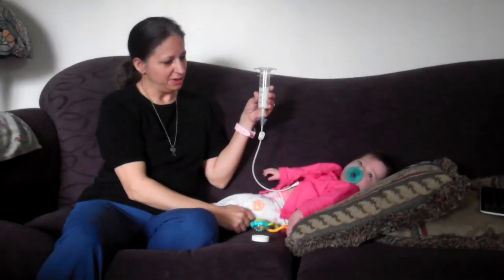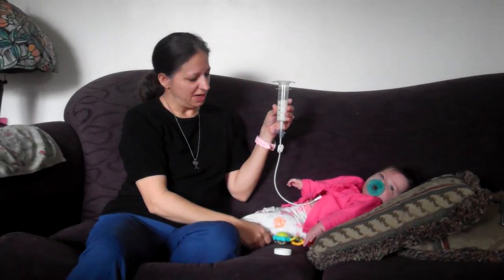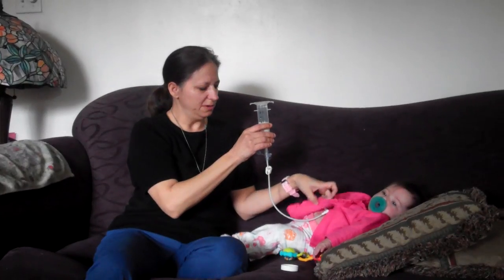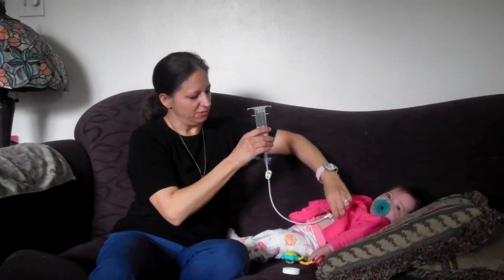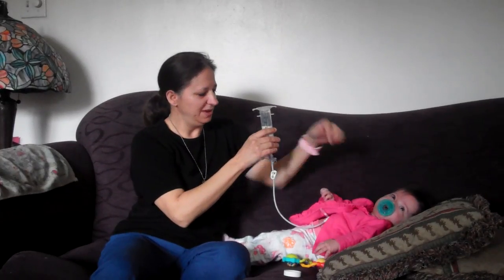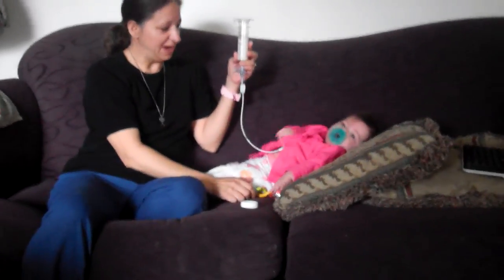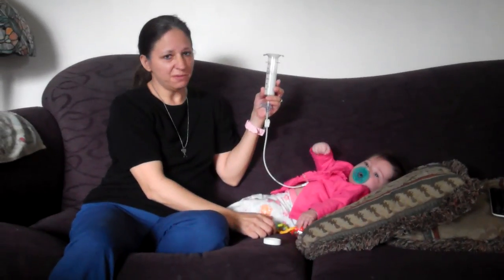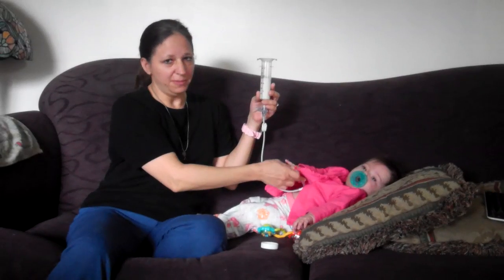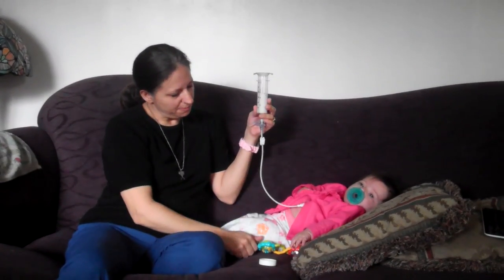And with Hannah, we put a little bit of thickener in there. If it's too thick, it doesn't want to go down, but you're going to learn all this as you go. Now, also with Hannah, you notice if you've seen up close, it looks a little bit red there, more pink. And when we first brought her home, I was very concerned about that. But that's just with Hannah. It's not really irritated, it's not infected, and it doesn't seem to bother her at all. And so it's just kind of where the button is.